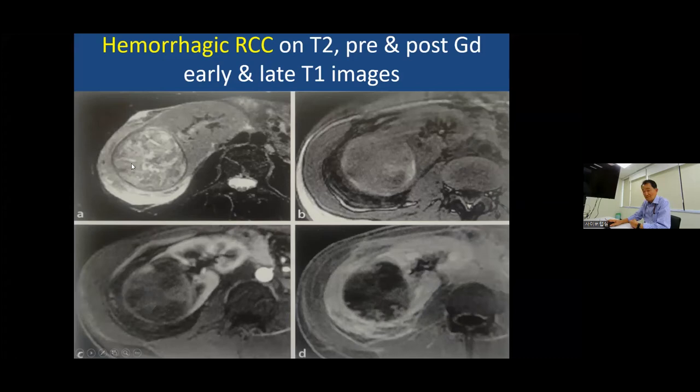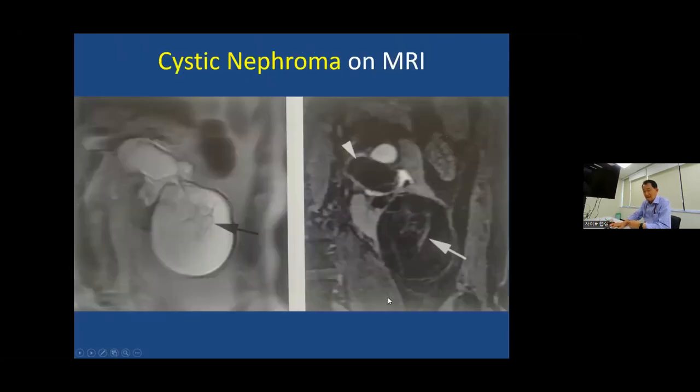It's multiple sequential MR imaging, so you characterize better. But heterogeneity is a hallmark of any malignancy because inside there's a combination of hemorrhage, infection, necrosis, etc. There's also cystic nephroma. Nephroma is a similar name to renal cell cancer. But this is very well-defined and cystic, with some internal septation. This also makes us somewhat worried.